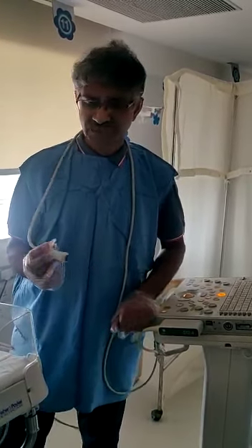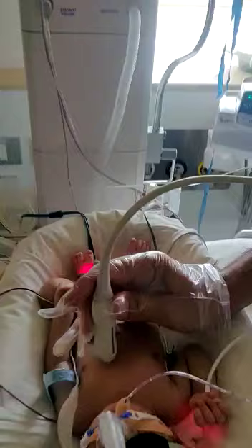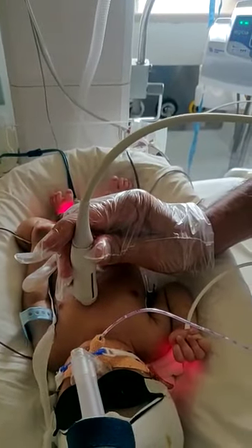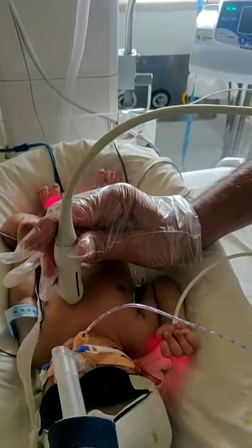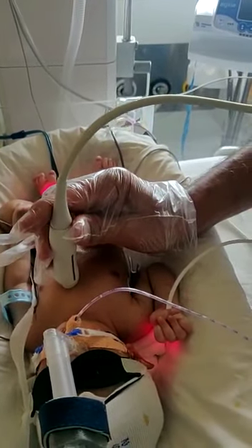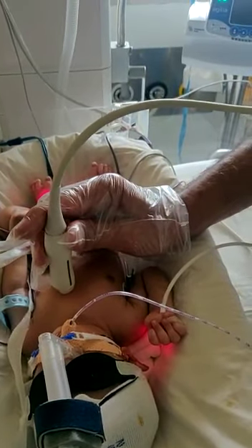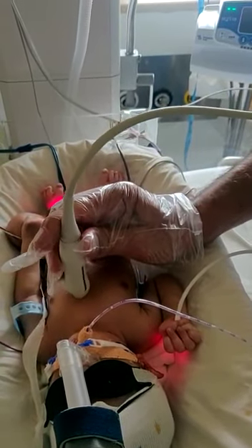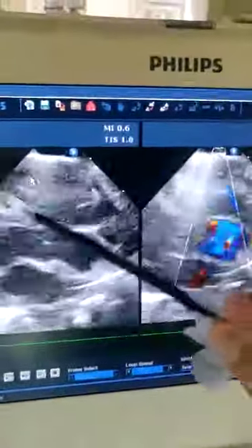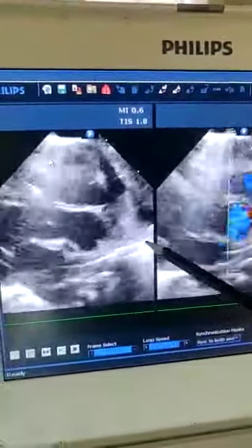On echo we did the parasternal long axis. The probe is placed in the second intercostal space on the left side of the chest with the marker facing to the right shoulder joint. And as you can see on the screen, this is the 2D moving image on parasternal long axis.